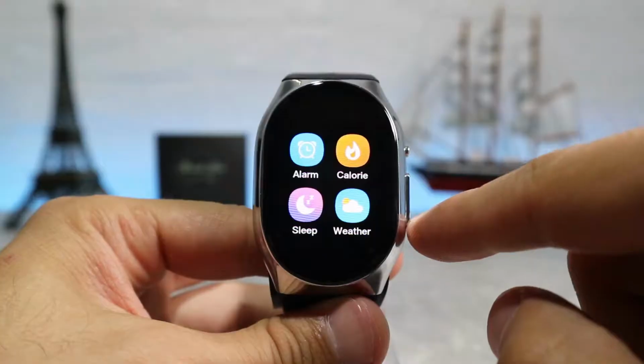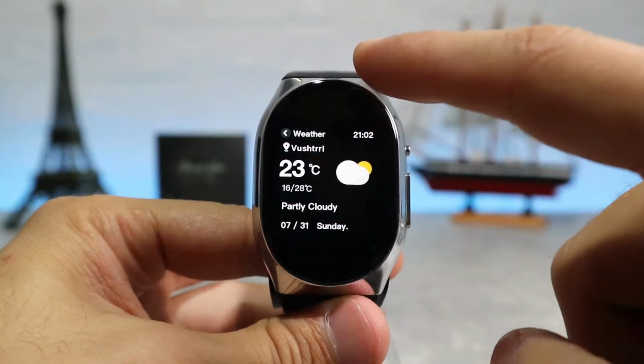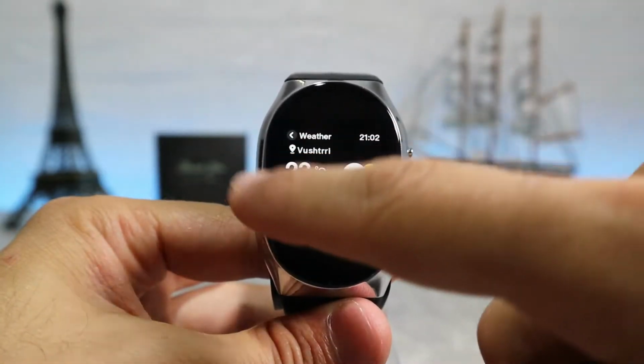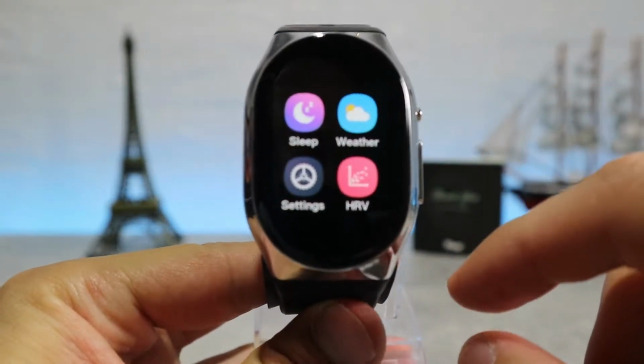Next, we have weather to see our current and upcoming weather and any information you want about the weather conditions. If we scroll down one more time in the menu, we'll see the HRV and settings icons.